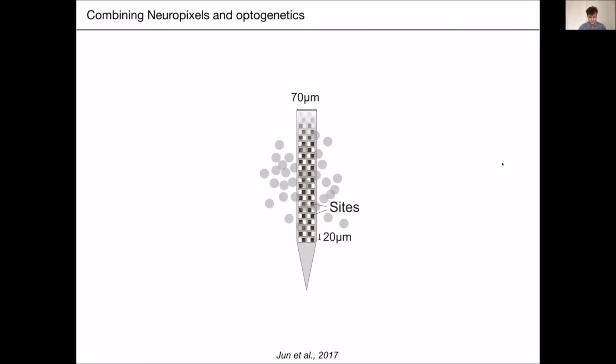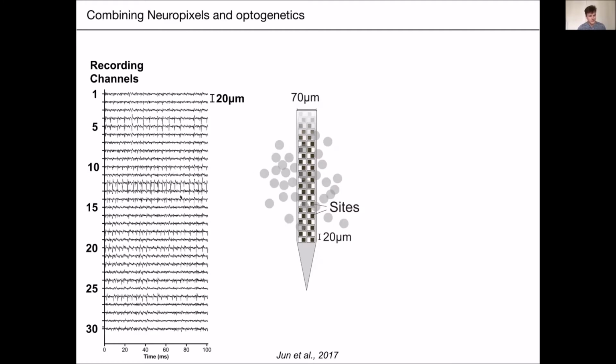So first of all, here's our setting. You just delicately inserted a brand new Neuropixels probe in the brain, and you fire up SpikeGLX or OpenEphys, depending on which software you want to use, and you get some data. And you're very happy. You see beautiful spikes, which are spanning several channels due to the high density of the Neuropixels probe.